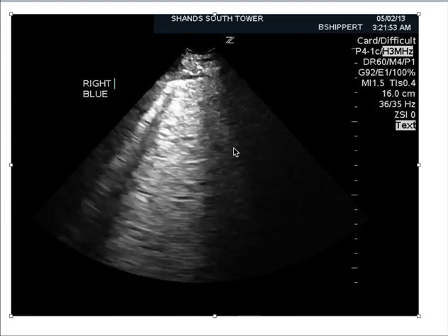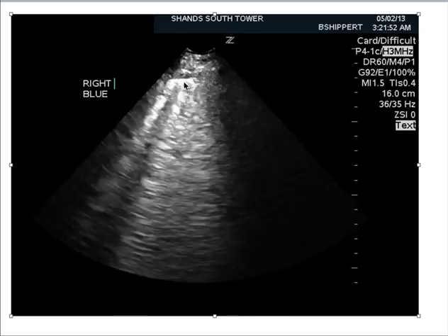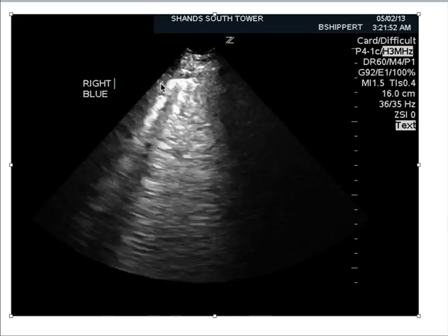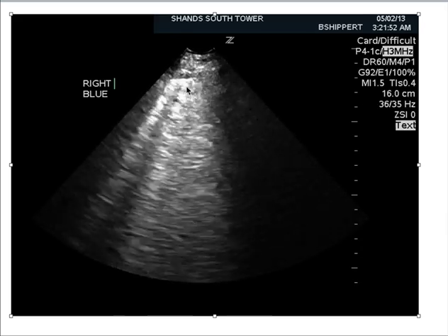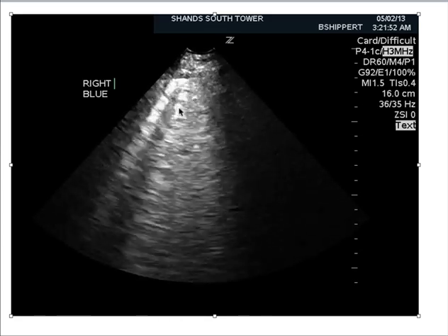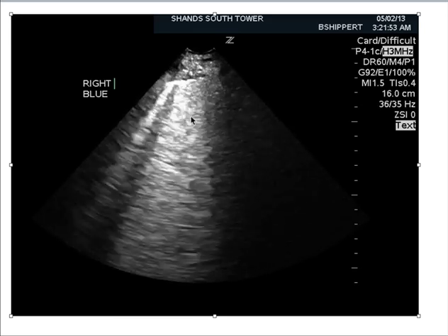Here's a patient with B lines. Although it's hard to tell from just a one or two second clip, or if the patient's moving, you can definitely see some lung sliding right here. Remember, if it's difficult to see, you can always zoom in on the pleura and look at it closer with a different type of probe — either a vascular probe or lung presets.